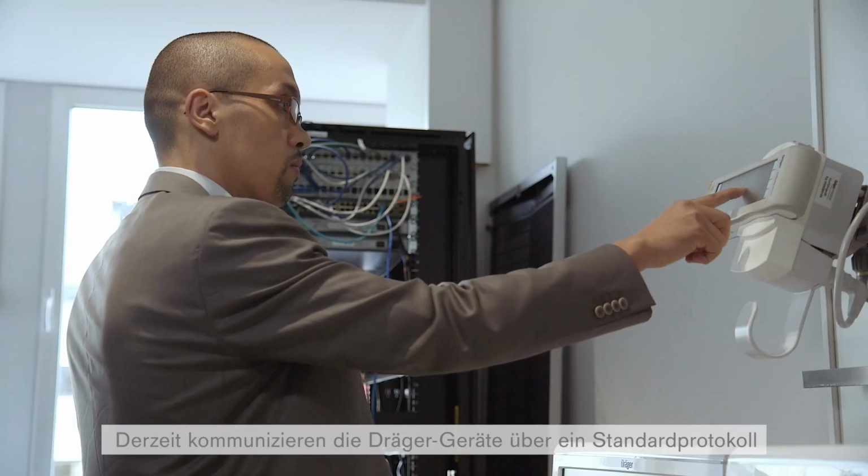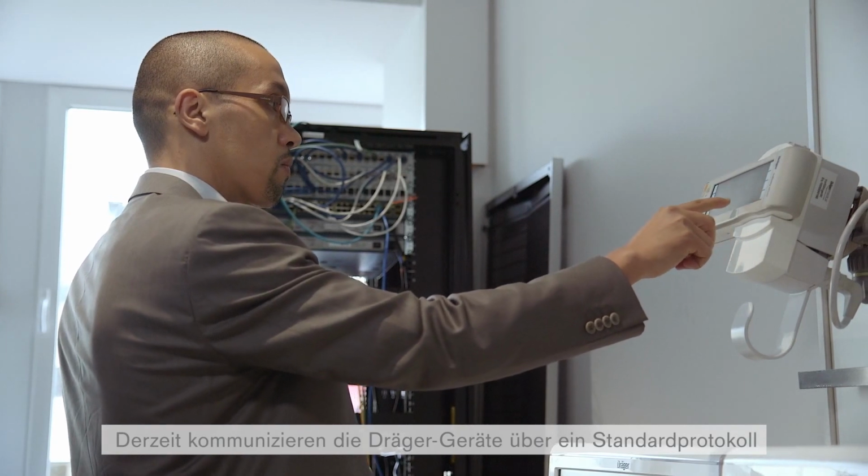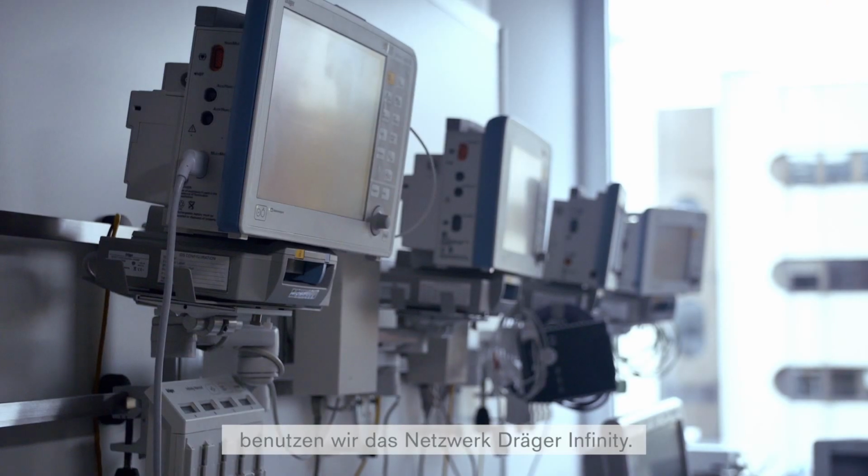Currently, for the communication between Draeger devices, we use a standard communication protocol, so it's a serial communication between devices. We collect information such as waveforms, alarms, trends, and the settings coming from our ventilators, such as the Evita V500. When we need to communicate that information to our clinical information system, we use our Draeger Infinity network.